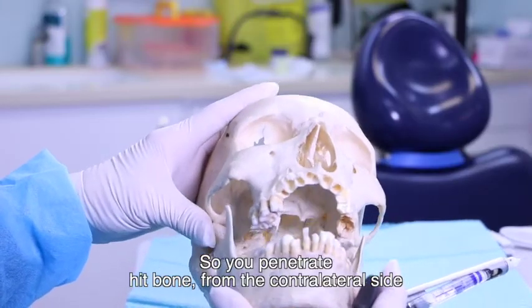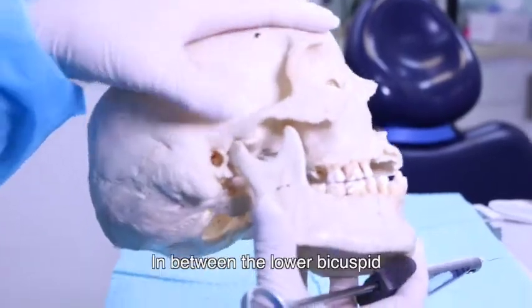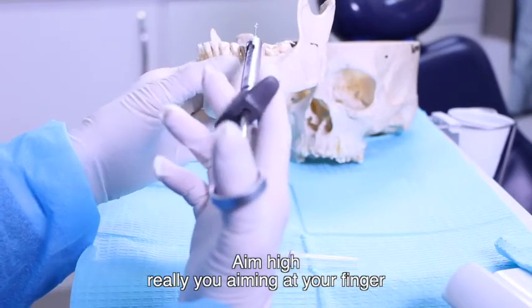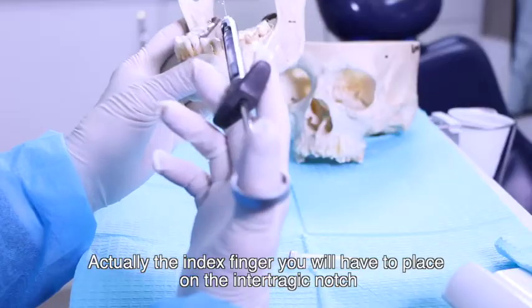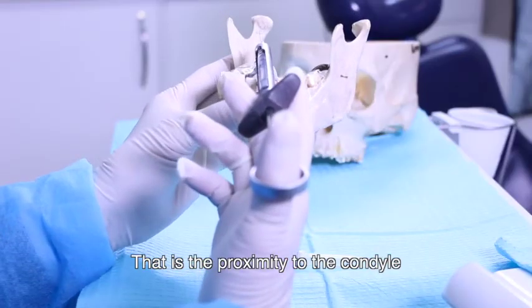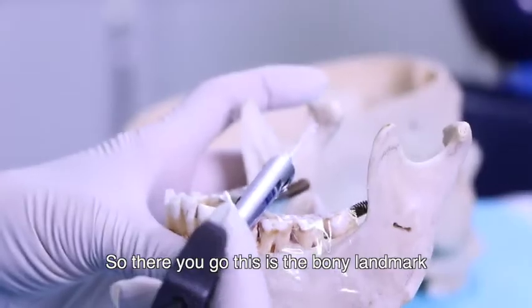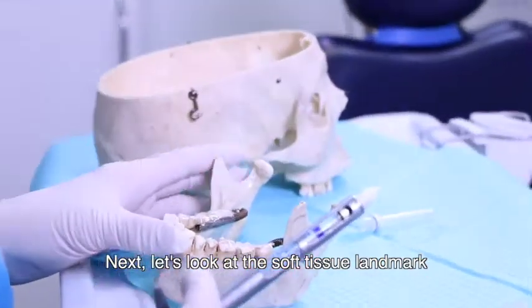So you penetrate from the contralateral side in between the lower bicuspids. Aim high, really you're aiming at your finger. Actually, the index finger you will have to place on the intertragic notch. That is in proximity to the condyle. So there you go. This is the bony landmark. Next, let's look at the soft tissue landmark.